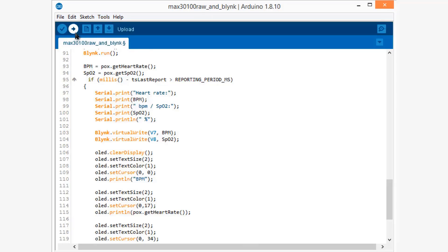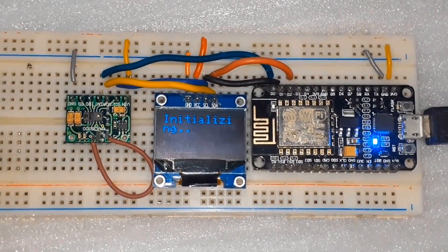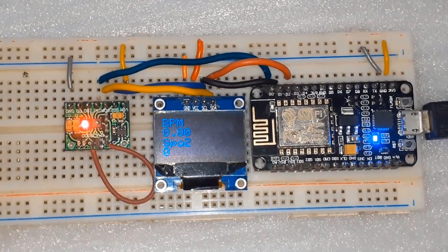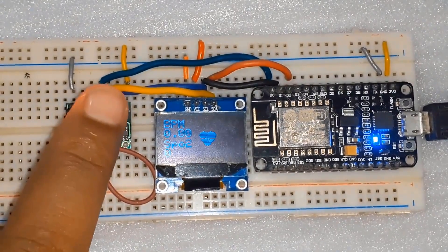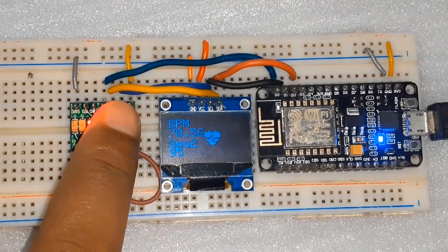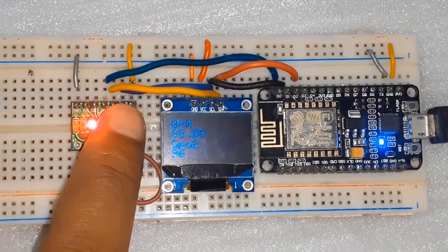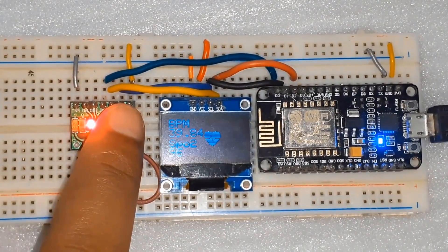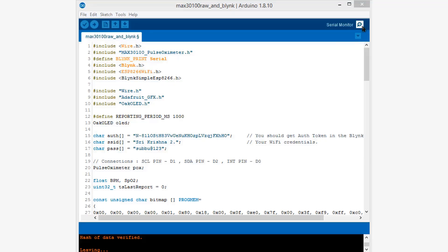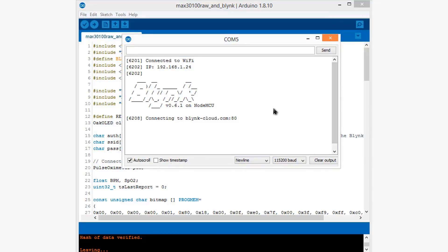Simply select the correct board and port, then compile the code and upload it to the NodeMCU. Once the code is uploaded, the OLED will show 'Initializing' until it connects to the Wi-Fi network, and soon it starts showing BPM and SpO2 values as zero. You can then place your fingertip on top of the LEDs of the pulse oximeter sensor, and the OLED will display your pulse rate and blood oxygen percentage.